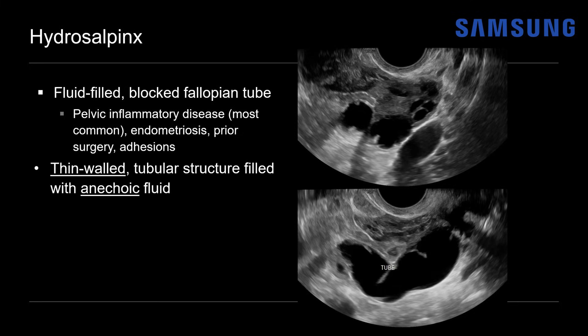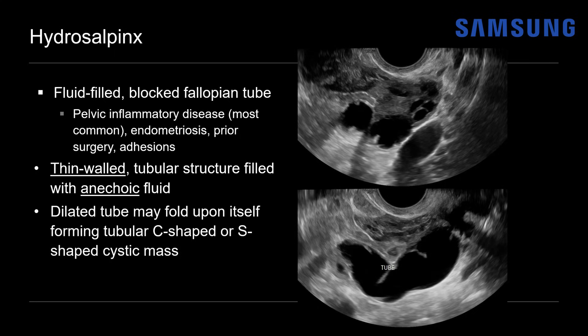On ultrasound, hydrosalpinx appears as a thin-walled tubular structure filled with anechoic or simple fluid. The dilated tube often folds upon itself, giving a c- or s-shaped configuration, which helps differentiate it from a cystic ovarian neoplasm, which is usually more ball-shaped. If septations are present, they'll be incomplete, as opposed to the complete septations typically seen in ovarian neoplasms or other multilocular collections.